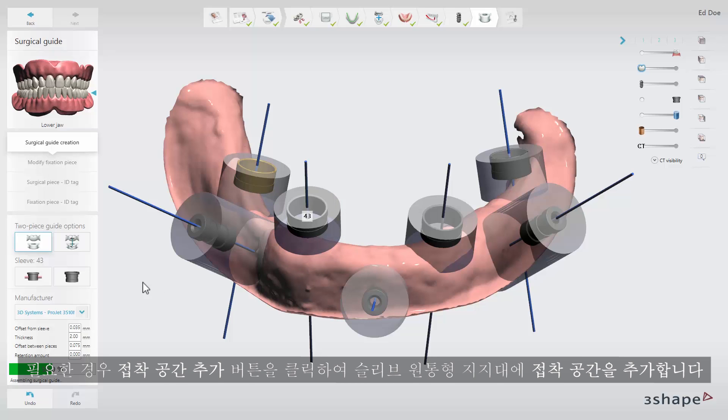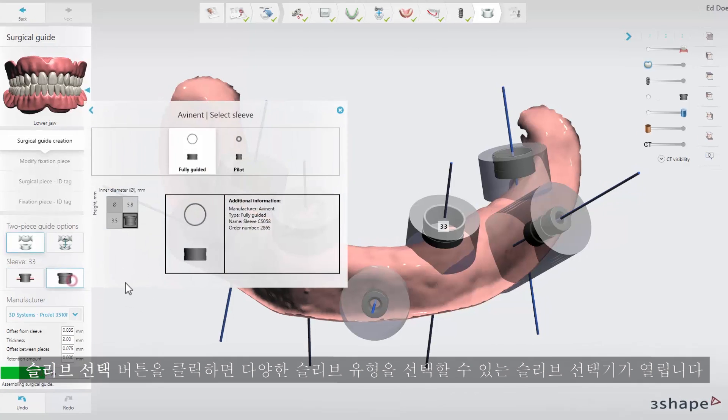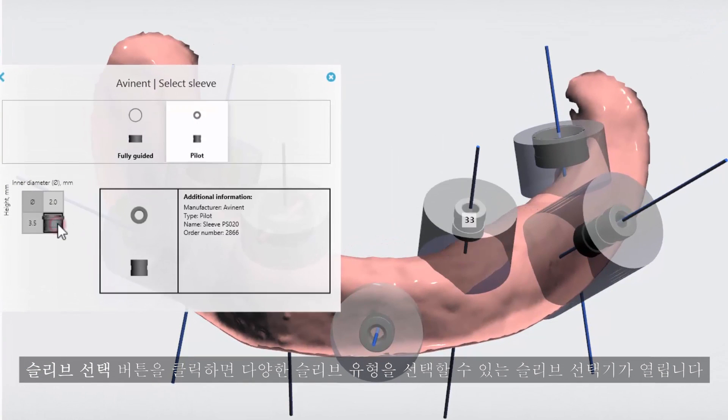If needed, add glue channels to the sleeve support cylinders by clicking the add glue channels button. By clicking the select sleeve button you will open up the sleeve selector where you can choose between different sleeve types.